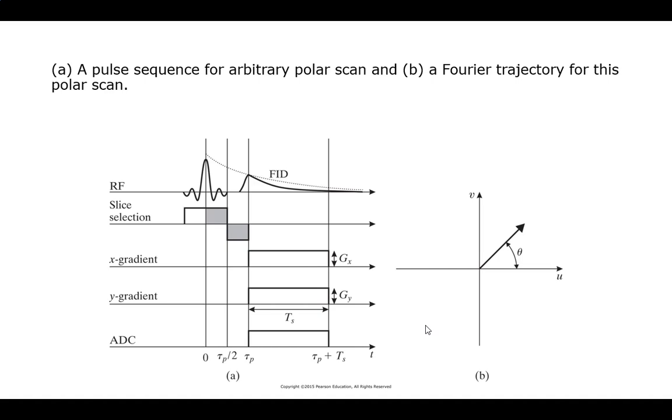Whatever line you're walking on, central slice, that's the same slice you're measuring in the frequency domain. So nicely it walks along those same. All I have to do is the perturbation. The ratio of these two heights will determine that angle theta. When this was 0, it was just straight down here because it's GX and no GY.